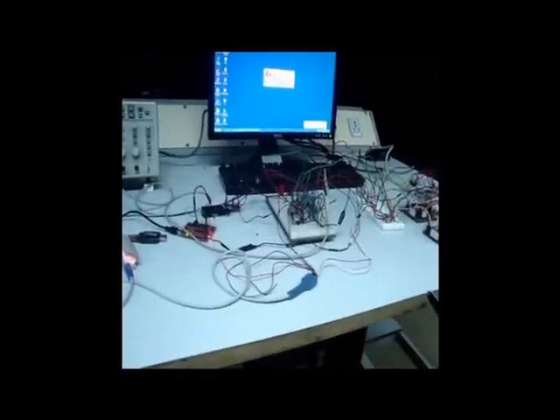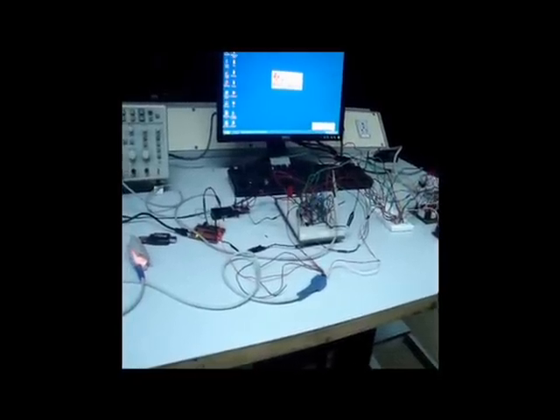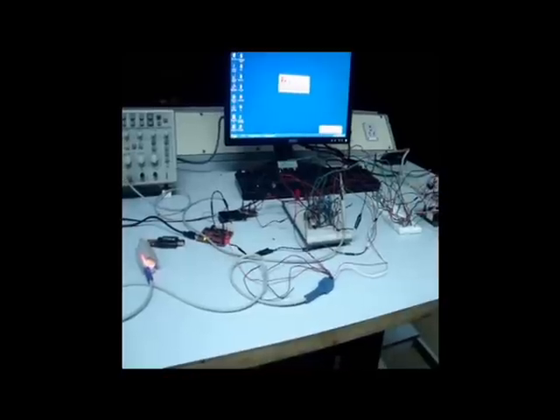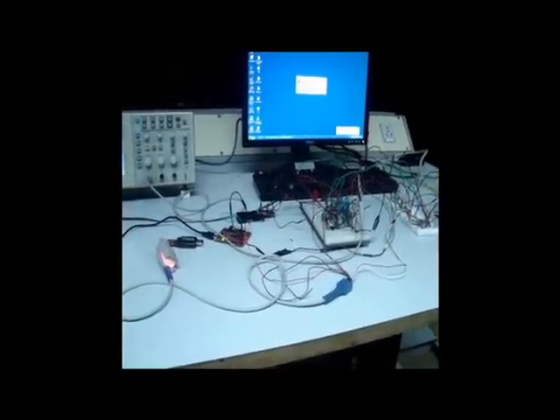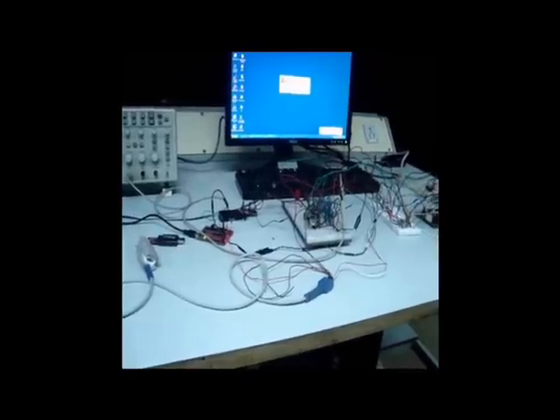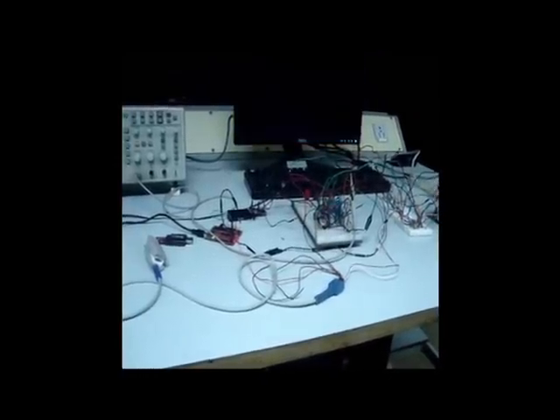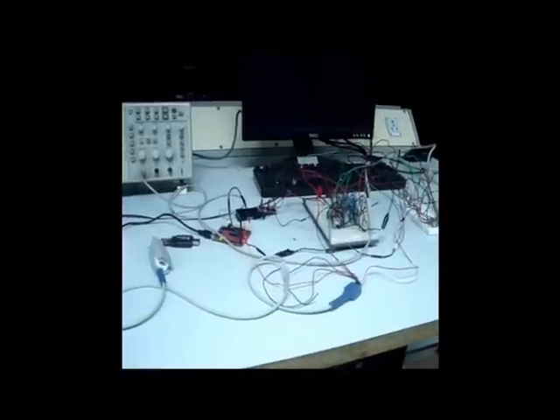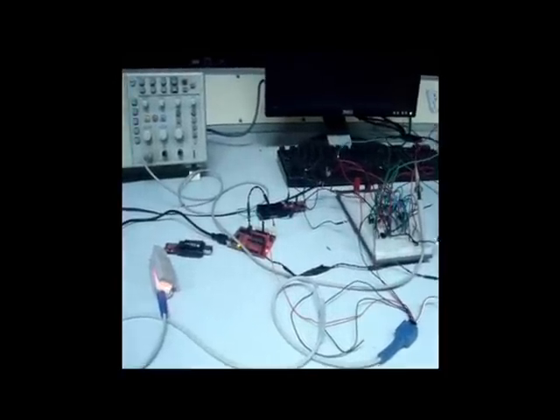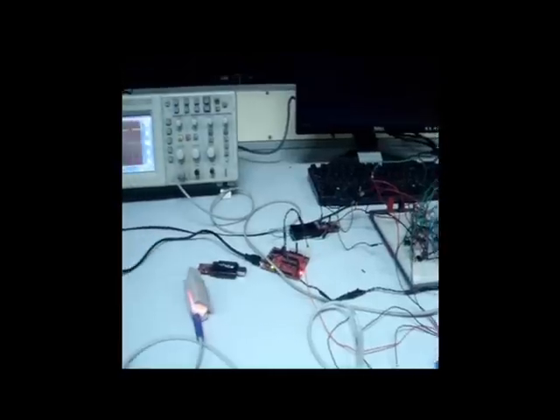A pulse oximeter is a medical instrument for measuring blood oxygen saturation non-invasively and continuously. It does this by shining lights on peripheral body parts such as fingers, earlobes, toes, etc. By measuring the absorbance of the infrared and the visible light by the blood after being reflected by the body tissues, it can determine blood oxygen saturation and heart rate.